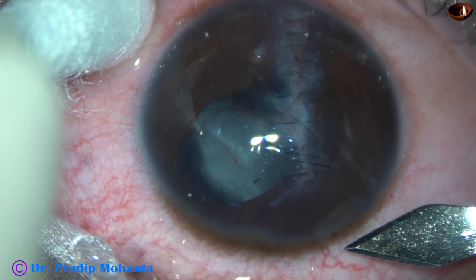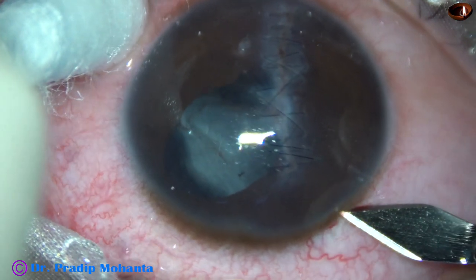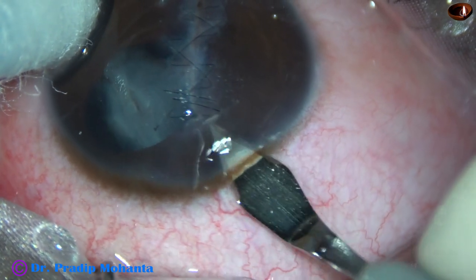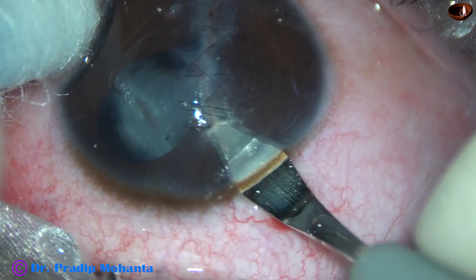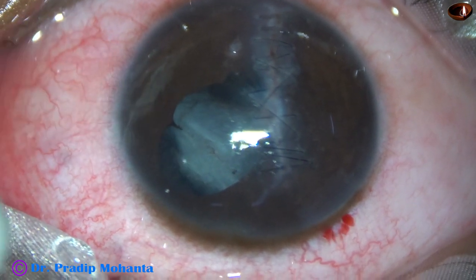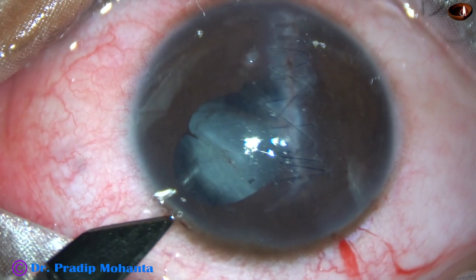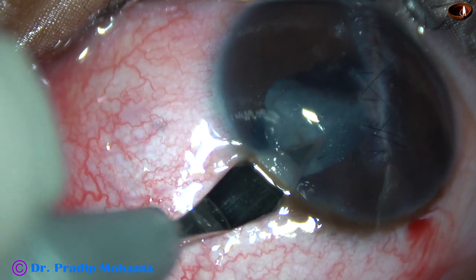He is under peribulbar anesthesia — not under general anesthesia. This is the main incision just posterior to the limbus. This is a 2.8 millimeter incision with a steel keratome, and now I make another incision about two and a half clock-hours away. This is about a 1.8 millimeter incision on the left side.